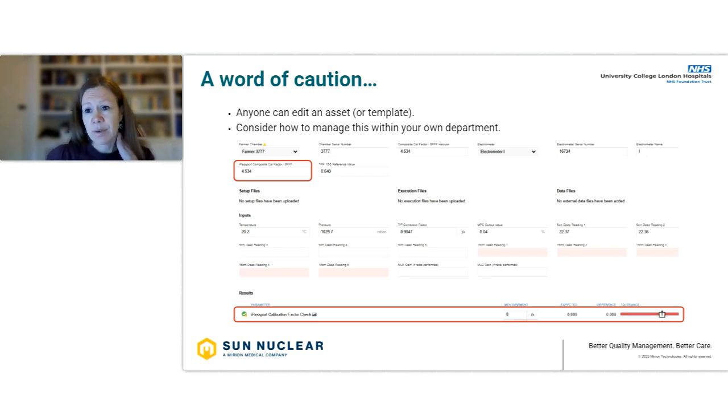And that's a process that was built into the way we do things before SunCHECK. We always get people to second check and look things up. So our users are perfectly used to that. But yeah, you need to think about how you're going to control that asset data.